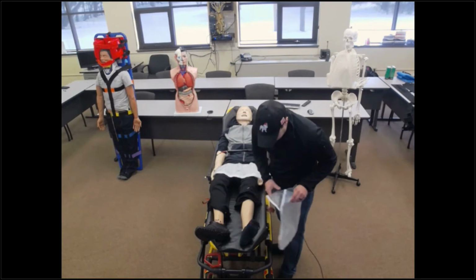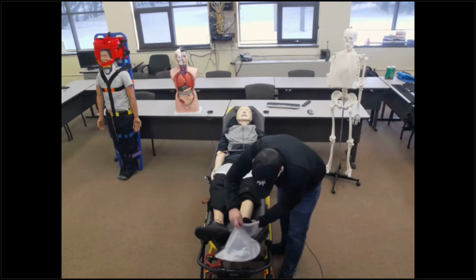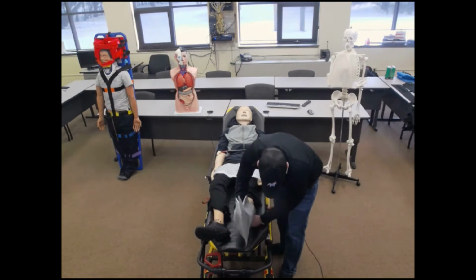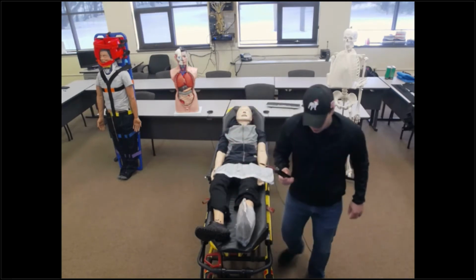Check CMS. CMS is good. Make sure that that is all the way in. Zip up your air splint and now take your air hose.